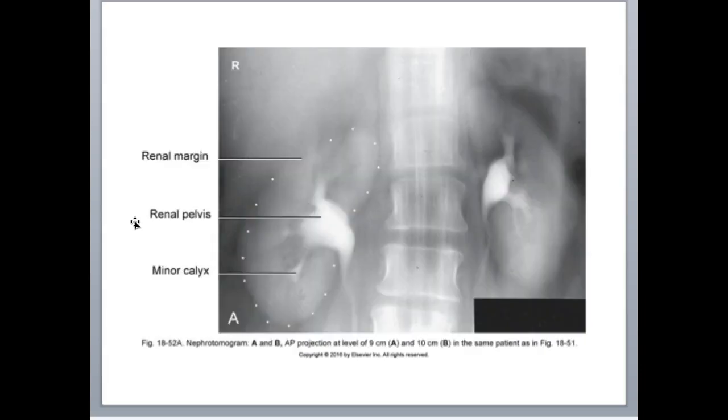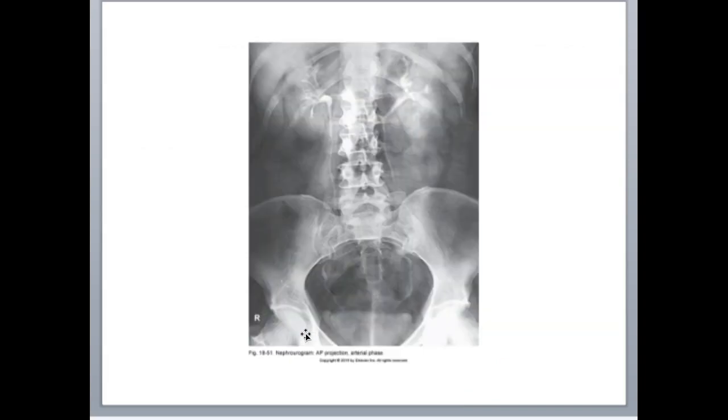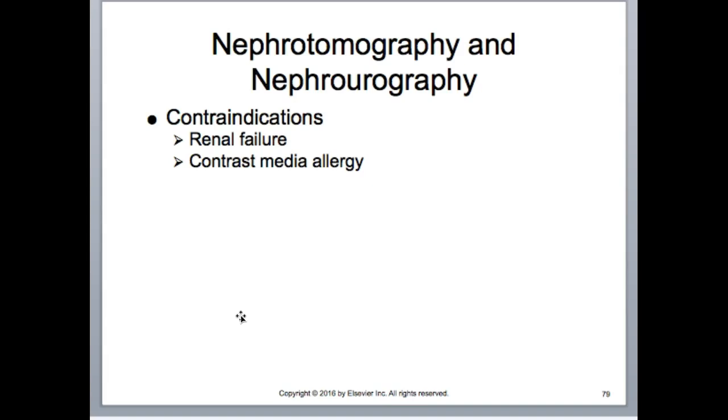So it shows it really well. And here, there are 2 projections. I'm only showing you one just to give you an idea. This one, A, is at a 9 centimeter. So you can see we're really well into the kidney on a 9. It's perfect for the pelvis, but on the left kidney, we're not in the kidney. We're not midline, so they don't sit the same inside the body. So a lot of the times you're doing 4 or 5 images to get through the kidneys so you can see both of them well. Okay, so here is just a KUB of the kidneys.